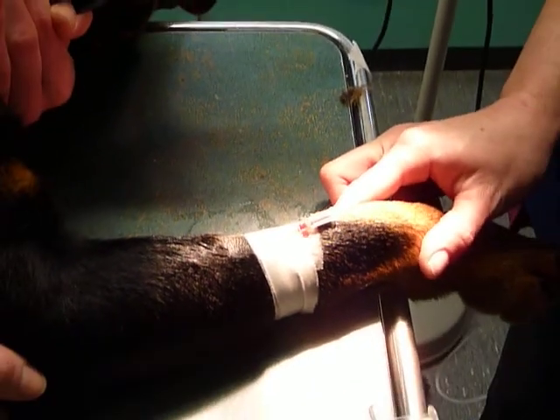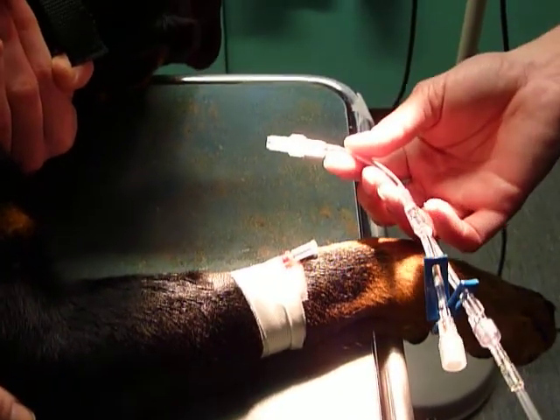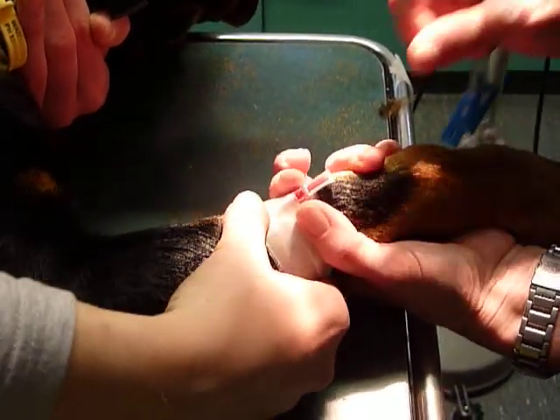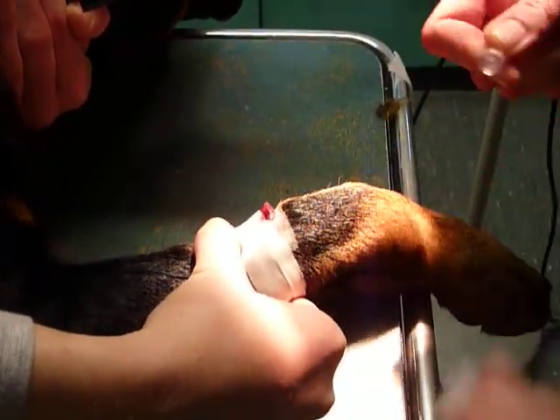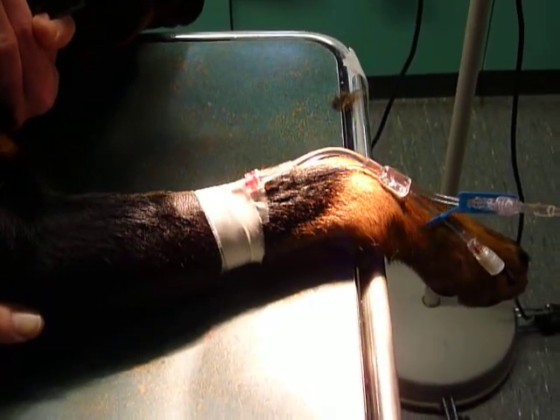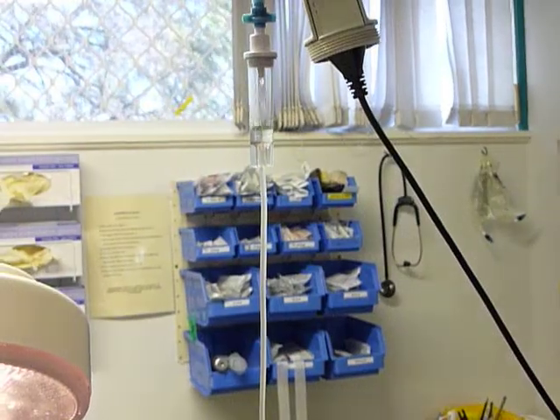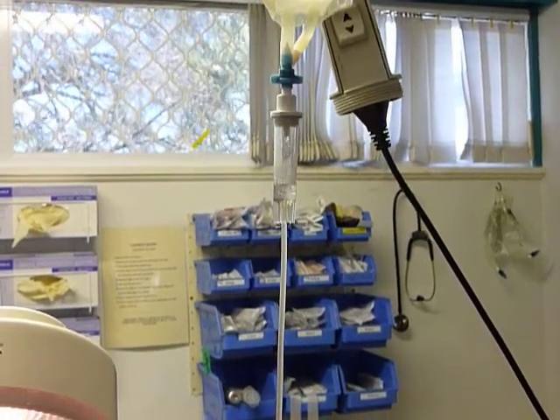Then we can place on our IV fluids or our catheter cap. Today we are going to be placing IV fluids — this dog is having a bitch spay. Get your veterinary nurse to again stop the blood, remove the cap, and place the end of the IV fluid line directly onto the end of the catheter. Then turn on the IV fluid line using the tap and ensure you have the fluids running in quickly and easily. Then dial down your tap to the correct drops per second.